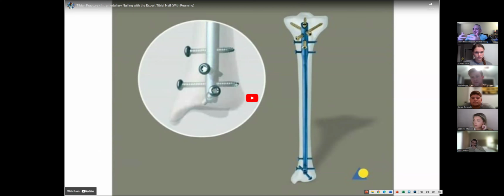So there are several factors. Sometimes you have to change it. For example, you don't have the specific nail you want, you have to use another one that is not perfect, but it's acceptable. But yes, classically, we select the nail based on the fracture pattern and the patient demands, which considers the biomechanical properties of the nail. This is the way we select the nail.